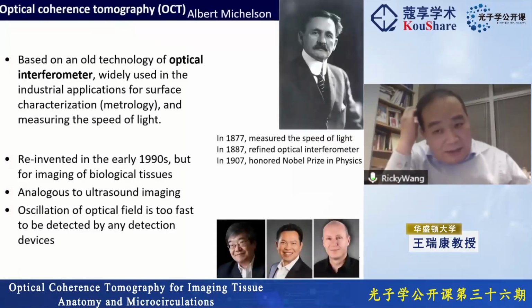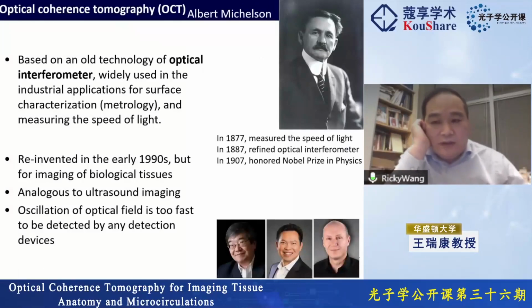I'm going to focus on OCT and how OCT works. Some of you may ask, what's the OCT? OCT is actually a very ancient technology. I think the first inventor for the OCT is actually Michelson. We know the Michelson interferometer, right? I remember that in my high school physics, my physics teacher already taught me how the Michelson interferometer works, and that's a really ancient technology.